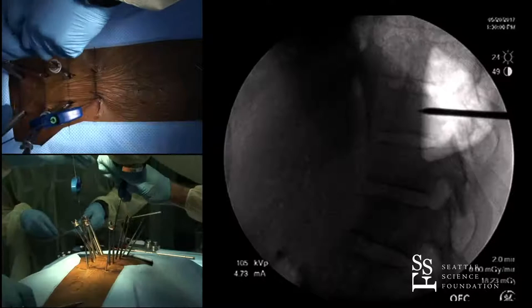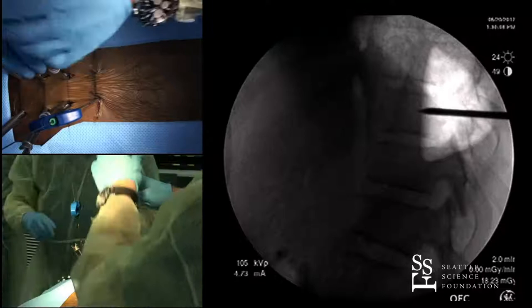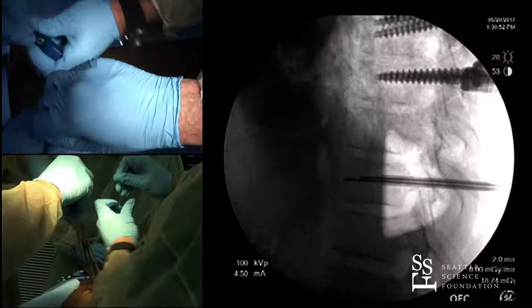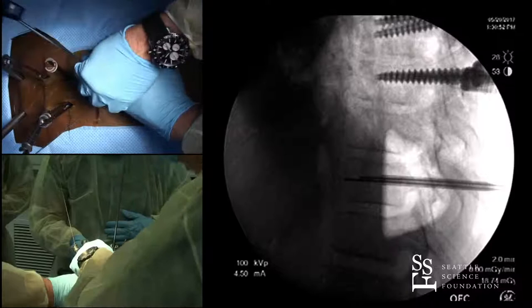Usually I can push the guide wires in, but sometimes if they're a little stubborn I'll grab them with a bulldog or heavy needle driver and tap them in. Both wires are in — I'll back the Jamshidi needles out now. It's a little tough with these long ones, but I'll wiggle them loose and back out while maintaining position. This is one of the places where you can run into problems because you can lose your wire.